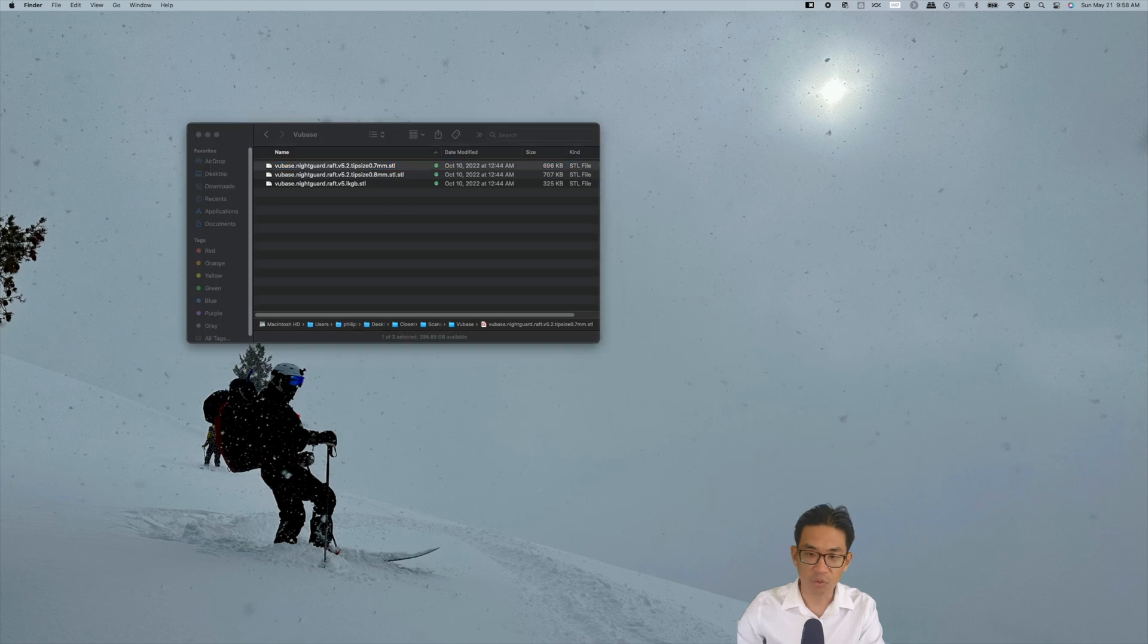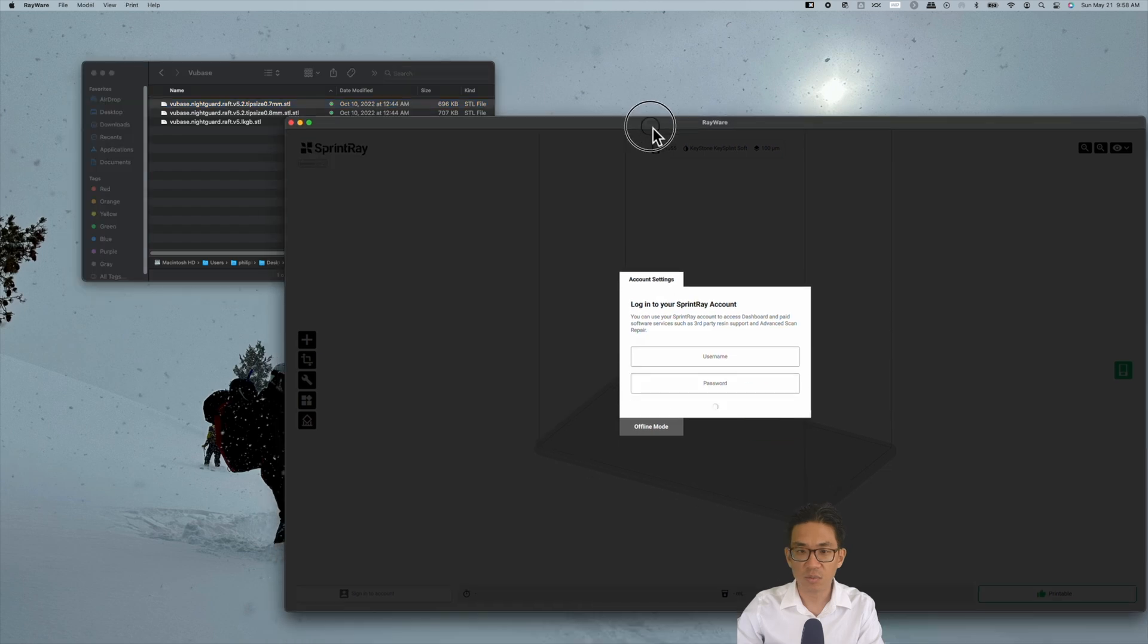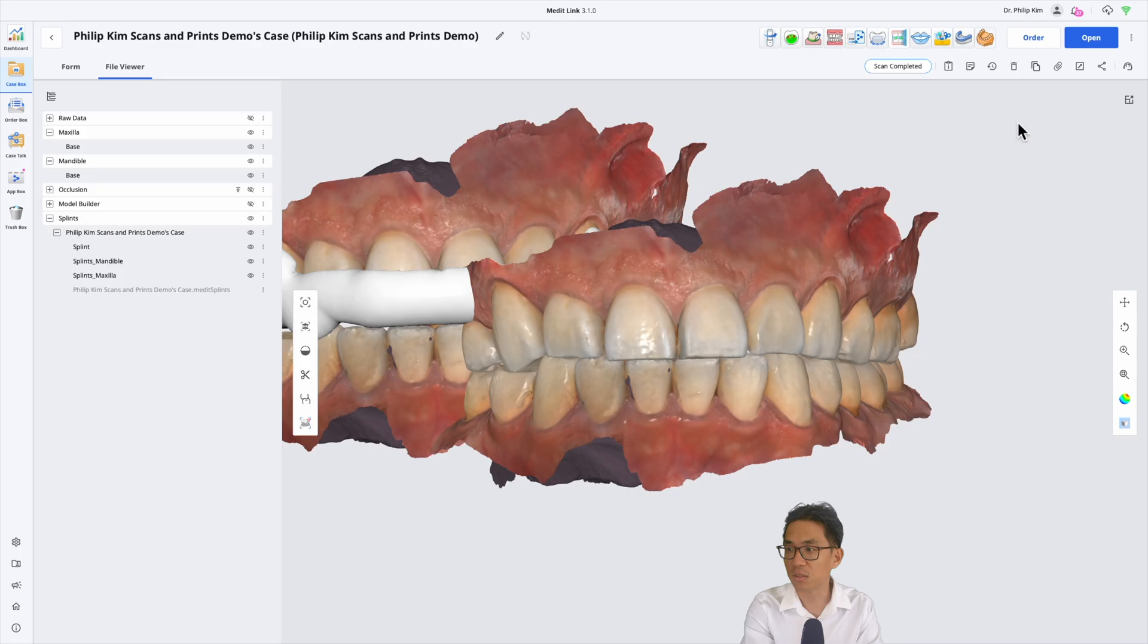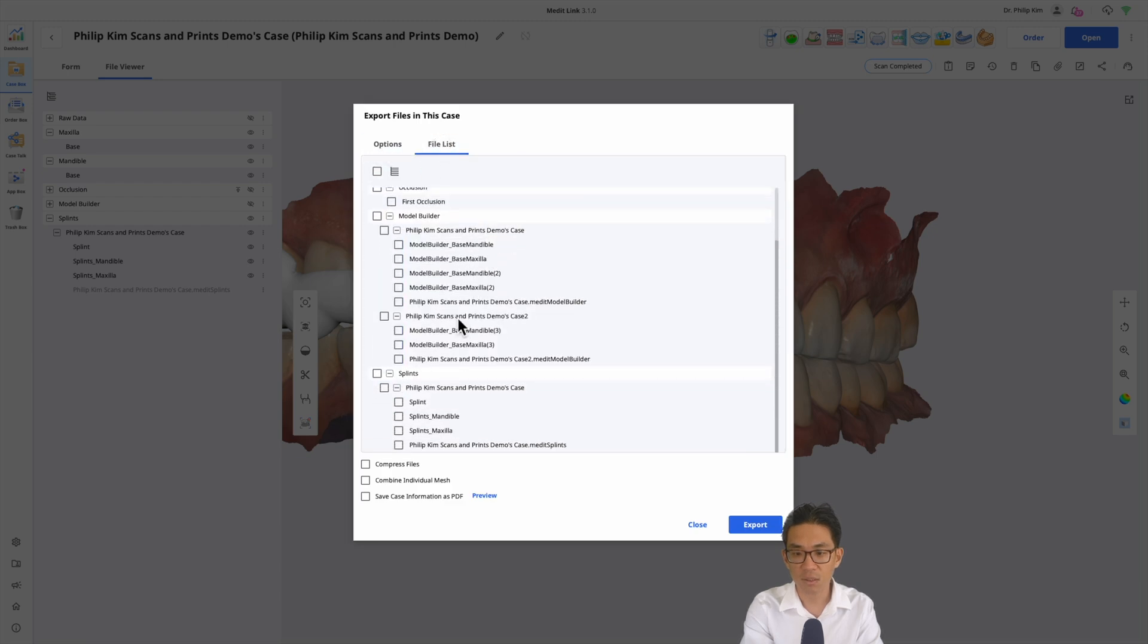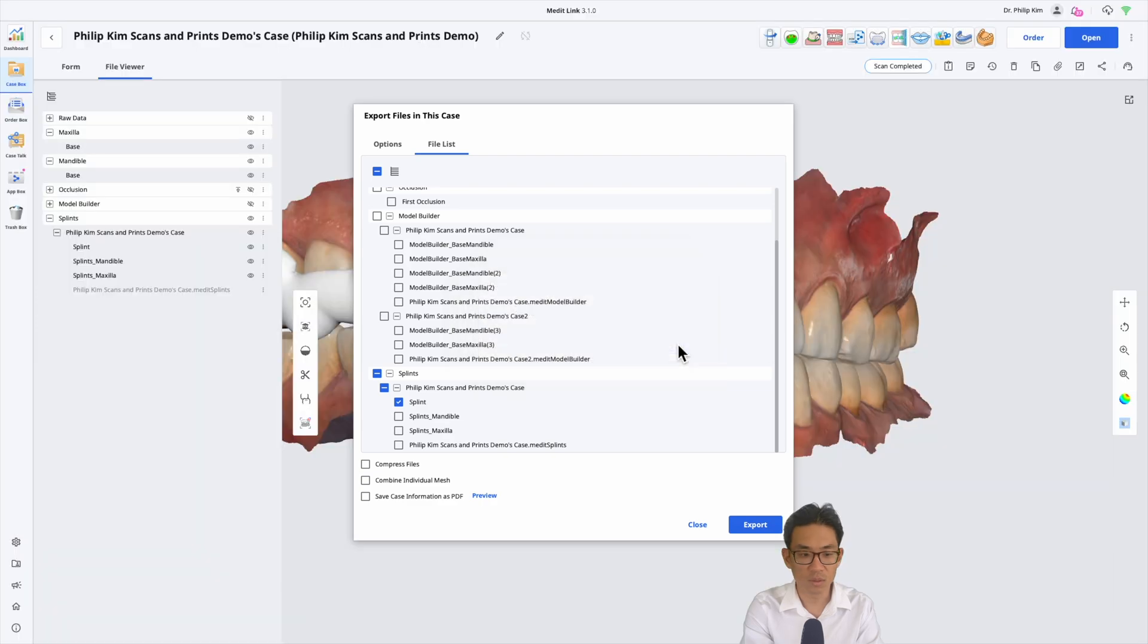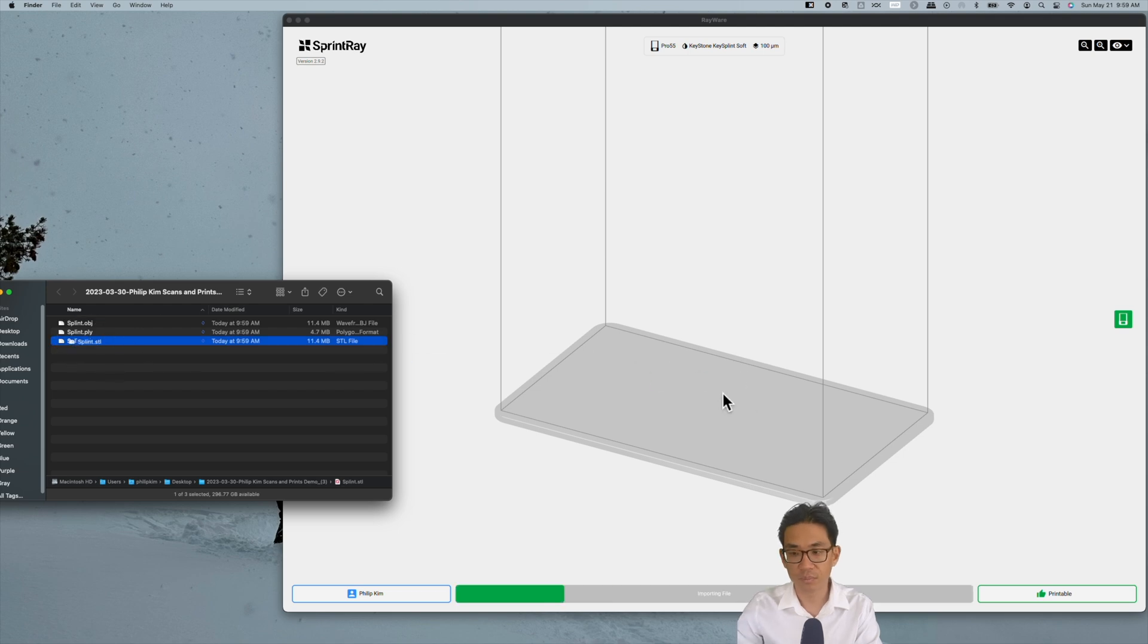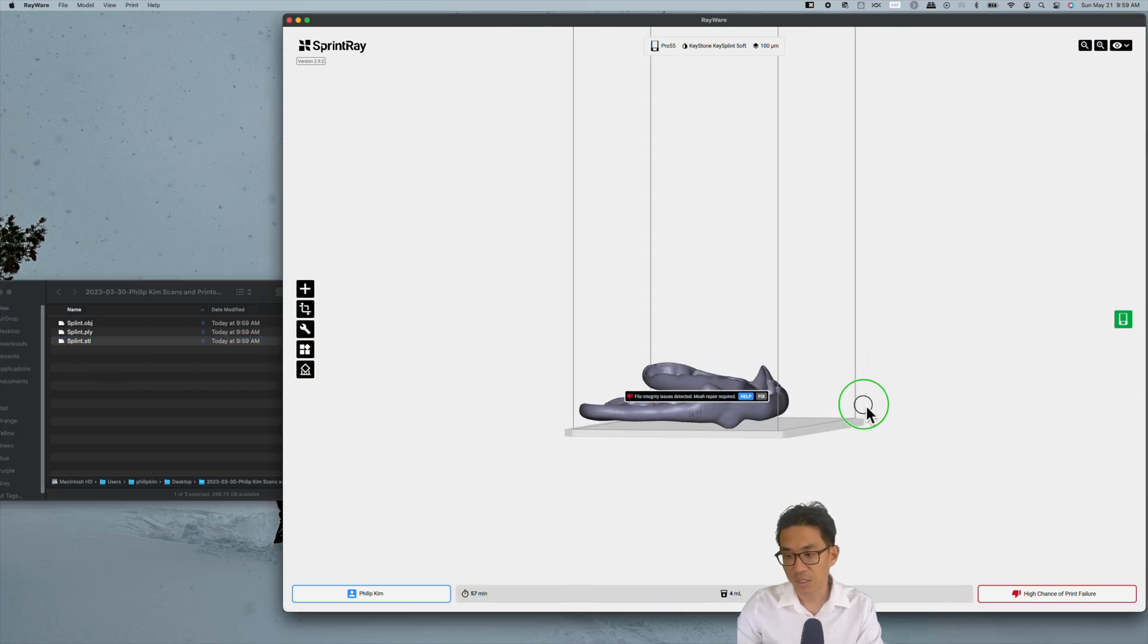What I did want to go over with you is now preparing it for printing using VuBase, which is an invention one of the doctors online had created. I will export and uncheck everything. All I want is the splint. Export and create a folder and export.